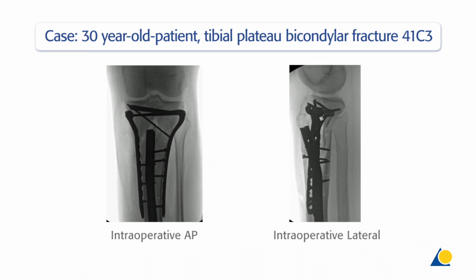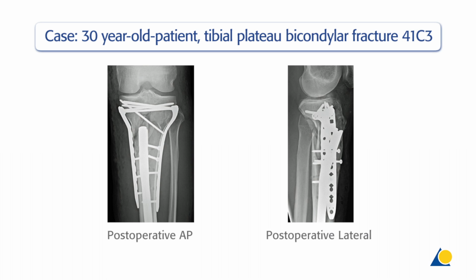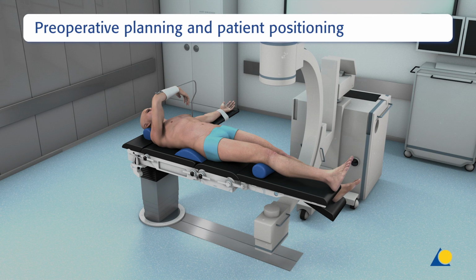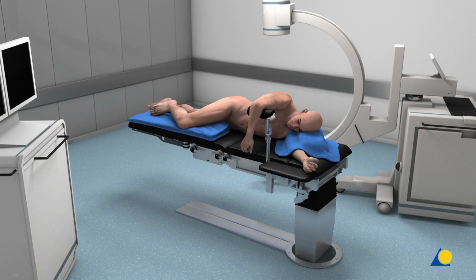The intraoperative image intensification shows the fracture fixation using the 3.5 VA LCP Proximal Tibia plate system. Early follow-up shows maintenance of alignment. The patient is allowed to move the knee through a full range of motion without restriction. In the vast majority of cases, the patient is positioned supine. However, some posterolateral fracture patterns can be managed with a lateral or floating lateral position.